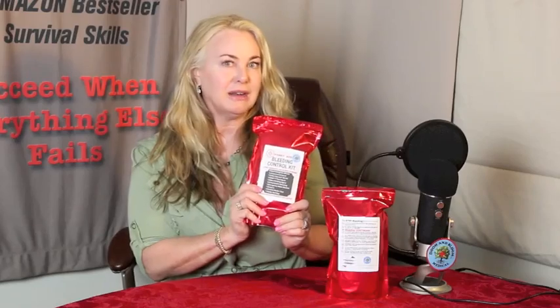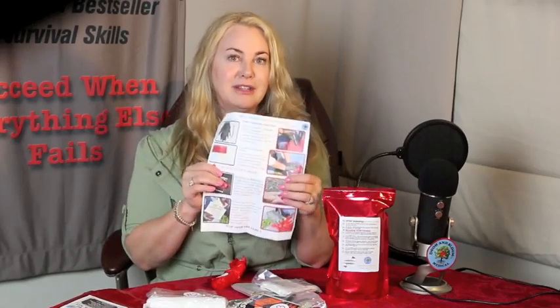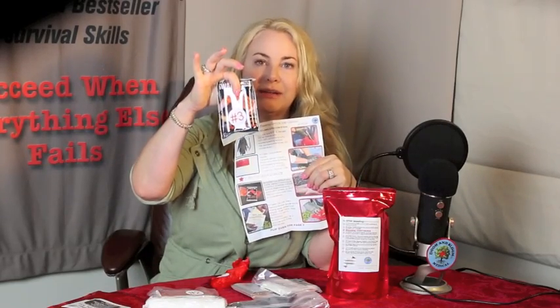Okay, so here's the kit, which comes in a sealed, highly visible bag with instructions on the outside. When you open it and dump the contents out, as a teacher might to help a student who is bleeding from a gunshot wound, you can see there is a waterproof or blood-proof instruction sheet there as well. Remember that this person may not be medically trained and will be agitated, so I give you two places to find instructions, one here and one here. The waterproof instruction sheet is clearly numbered to coincide with the numbers found on each item, as you can see here.